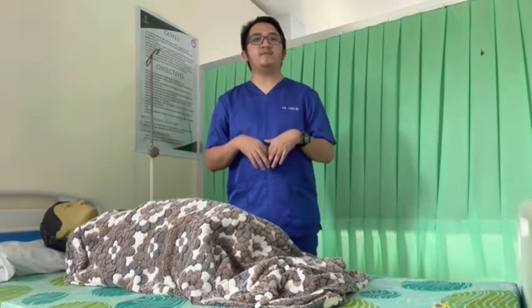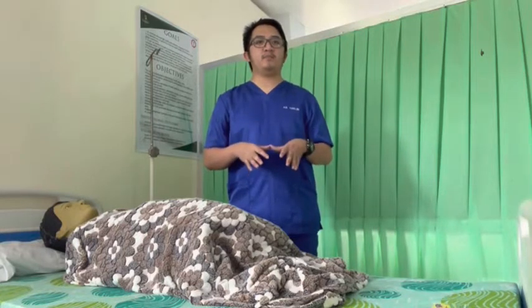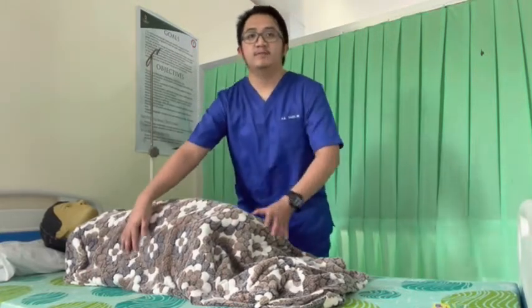During the procedure, the patient is positioned on the side at the edge of the bed or examining table, with the back toward the physician. This position allows easier needle insertion into the subarachnoid space of the spine, because it widens the space between the lumbar vertebrae. The thighs and legs are flexed as much as possible.